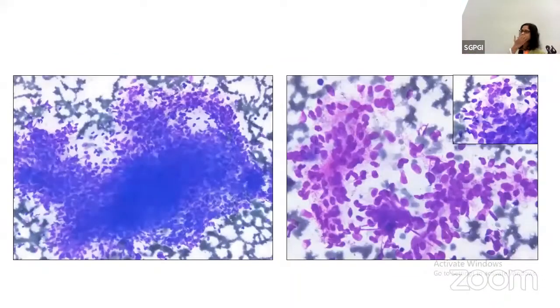Another case, so all these are similar. You'll end up calling all of these category 5 or 6. Another spindle cell lesion with the nuclei being blunt-ended. They have nondescript cytoplasm, no amyloid, no nuclear features which were like that of MTC. So again, you don't need to stand up. I think it will be category 6 or 5 depending upon the cellularity. This was category 6.